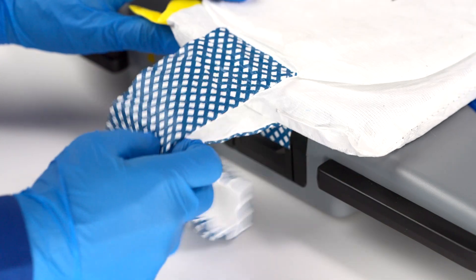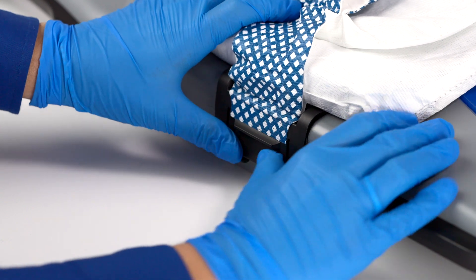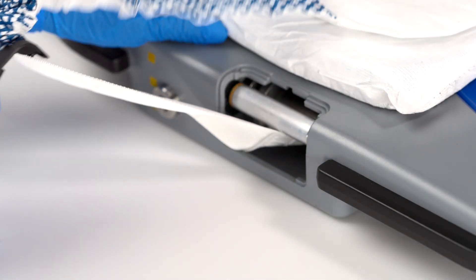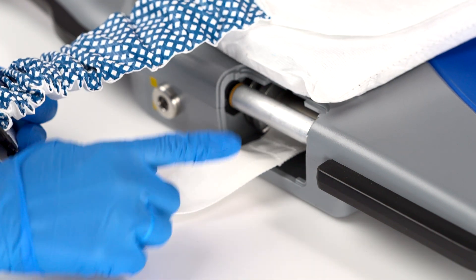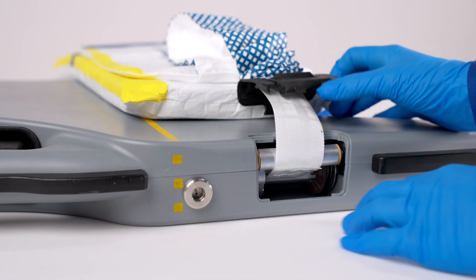To remove the AutoPulse NXT band, push the bottom or long side of the band guard up and lift it out of the guard port. Next, press the platform release away from the yellow line to release the pin. Remove the pin.